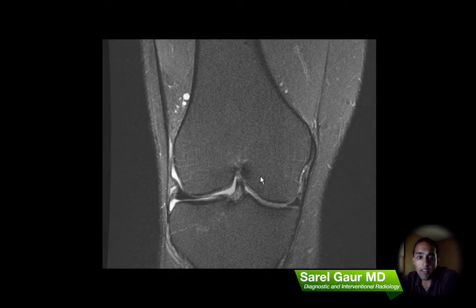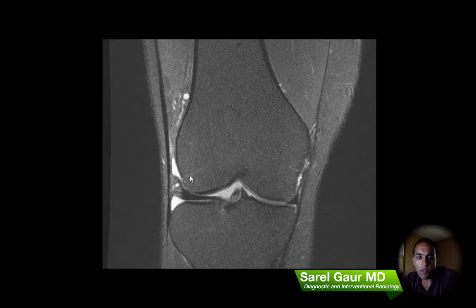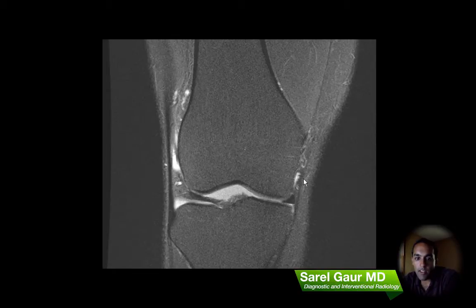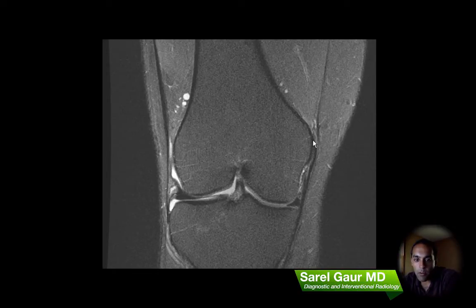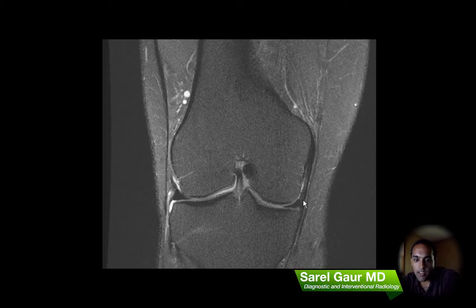Next on the checklist are the medial and lateral supporting structures. I'm now looking at a coronal view of the knee — this is a T2 weighted fat suppressed image. Here I can find the MCL as this dark black structure, and it's inserting onto the tibia inferior to the joint line. I want to point out how intimately it's related to the meniscus here. This is all normal — there's no fluid cutting into the ligament — so the MCL is intact.